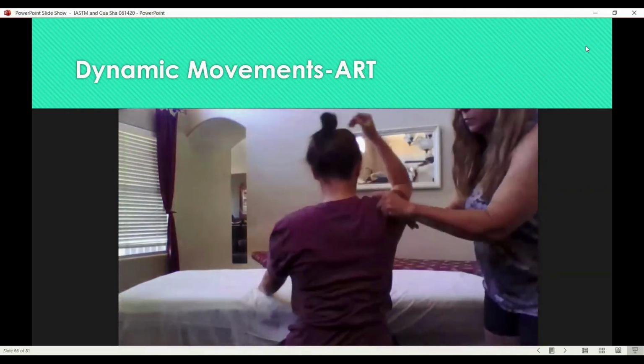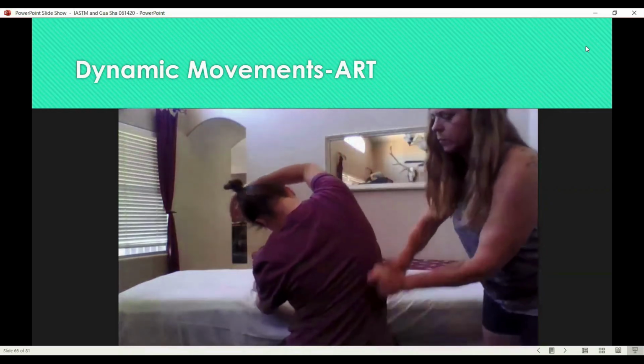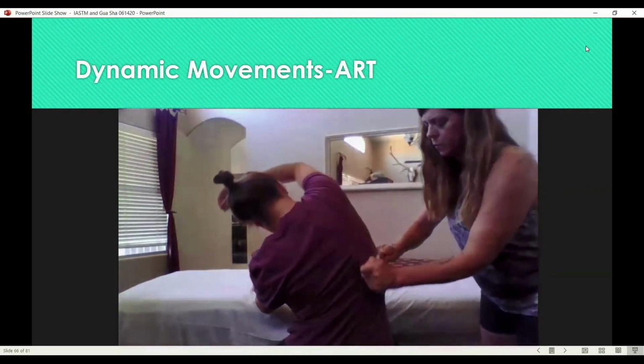Here, I'm just showing through clothing, right? But we could do this with a sports bra or something too.